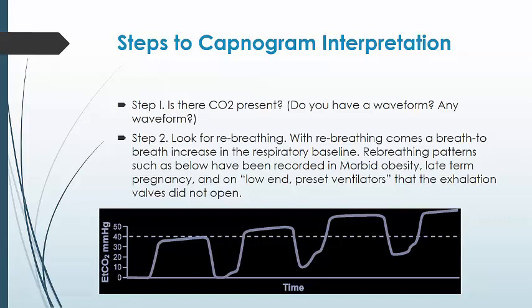So most manufacturers have increased the speed of the CO2 channel to a little bit faster than its normal rate, and this lets you see those waveforms across the screen in real time, but they are not diagnostic. So what you need to do is print it out. In order to properly interpret a waveform, other than just whether it's a square or a flat line, you need to print one out and look at it.